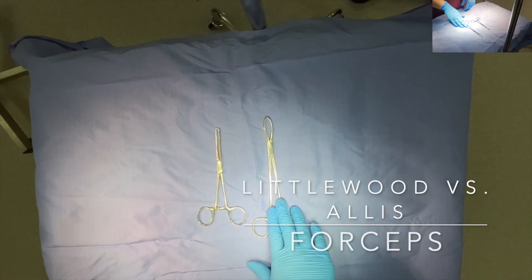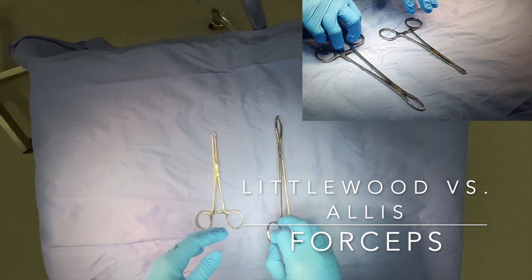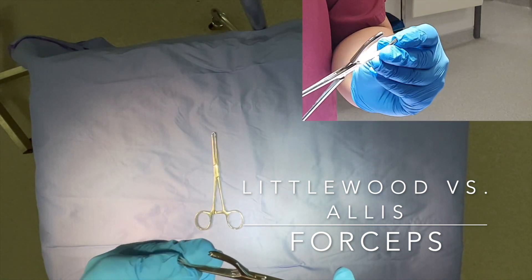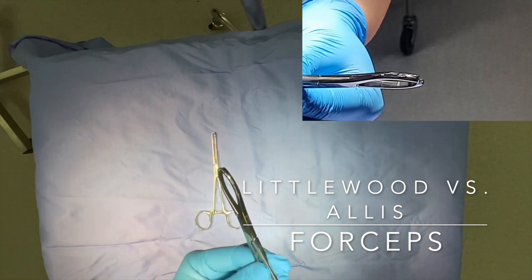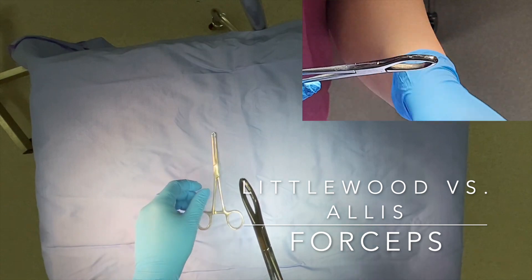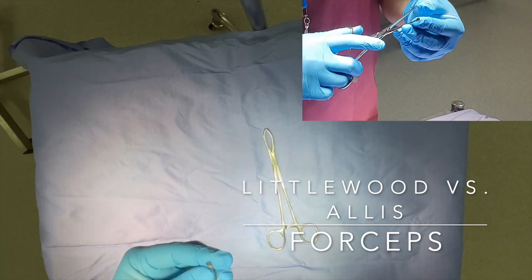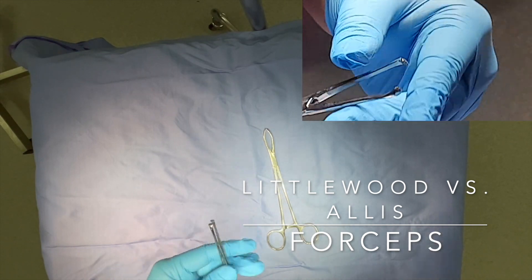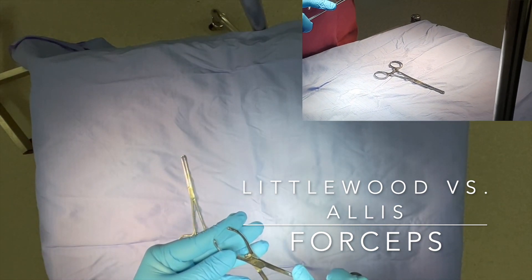On the right-hand side we have the Littlewoods forcep, and on the left we have an Allis forcep or Allis clamp. The Littlewoods forcep is used for holding heavy or robust structures such as the rectus sheath when closing the abdomen — it is toothed, making it a traumatic forcep, especially once the ratchet is locked. The Allis forcep also has sharp serrated teeth and is good for getting traction when clamped onto a structure. Both of these are quite traumatic forceps.